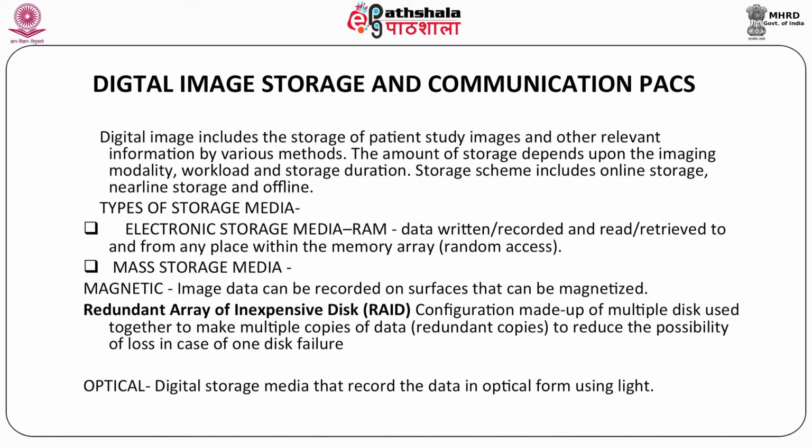A redundant array of inexpensive disks, RAID, is a configuration made up of multiple disks used together to make multiple copies of data to reduce the possibility of loss in case of one disk failure.